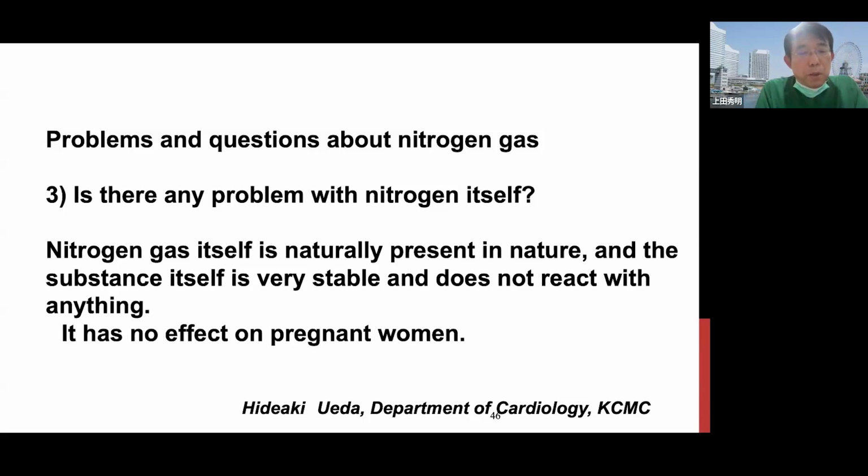If I find the patient has a very high saturation, we just start the nitrogen gas, because if we start the nitrogen gas containing about 15 or 18 percent oxygen, the saturation will drop to around maybe 85%.